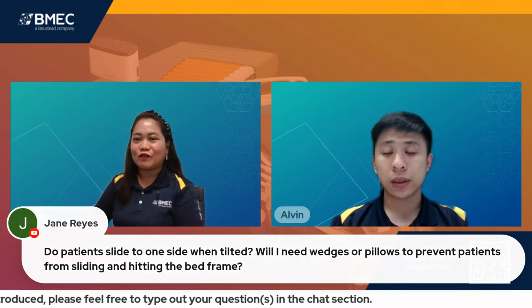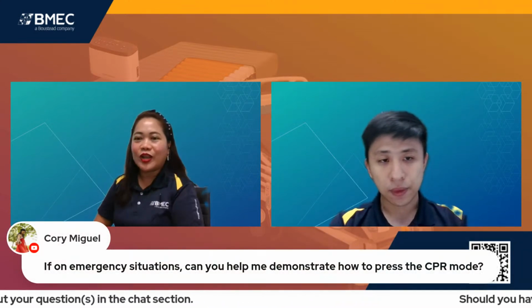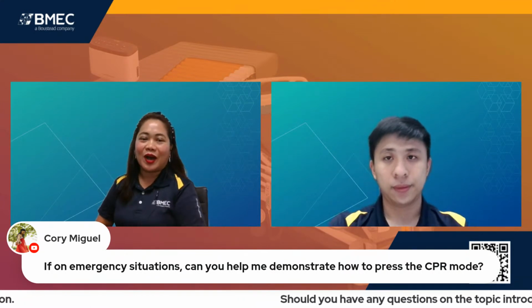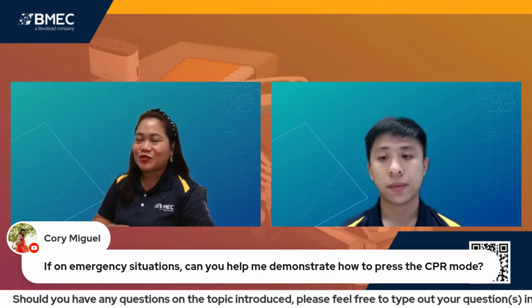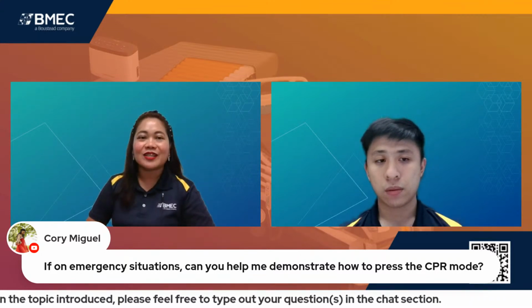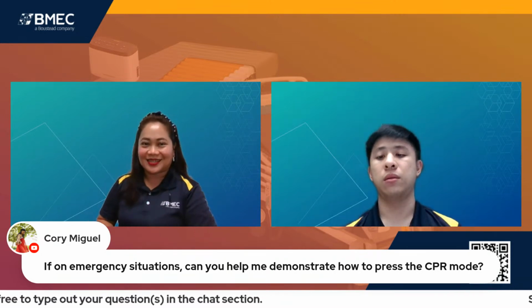Okay, another question from Corey Miguel. Thank you, Corey, for your question. In emergency situations, can you demonstrate how to activate the CPR mode? Yes, in an emergency, both Toto and the air mattress have a CPR button, and it takes a few seconds to activate the CPR mode.